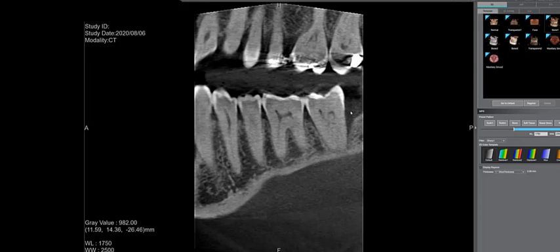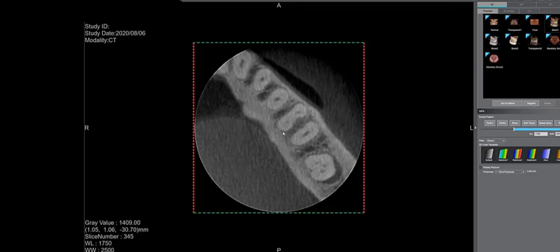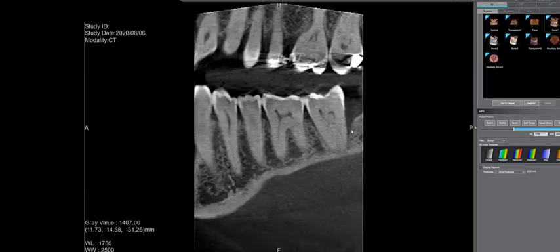Yep. And it shows that this machine has some pretty incredible resolution. It is quite amazing. And able to see the three-dimensional shape of the defect, because that helps in diagnosis as well. Yep. You said it exactly right, where had you not had this information, you might have tried other things that may cause more risk and worse outcomes, and it would have possibly taken you longer to get to that conclusion without the information.